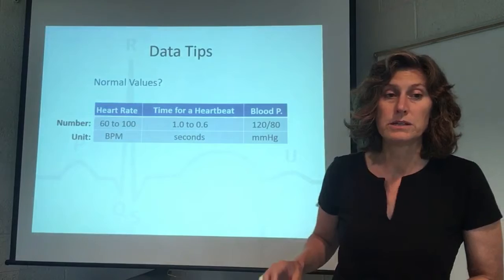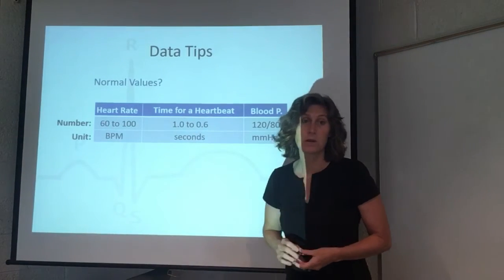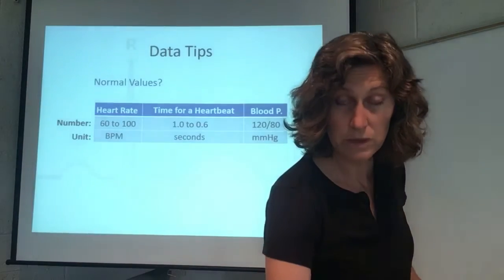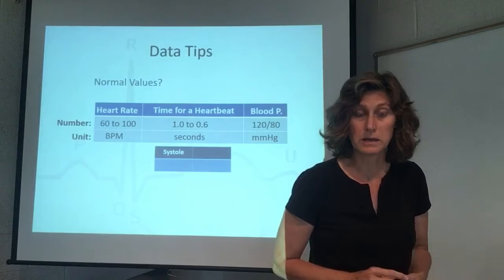Now, if we dig a little bit deeper in the time for a heartbeat category here, then we can split it up between systole and diastole.